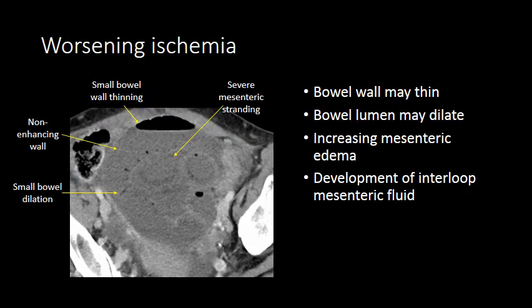As you see the ischemia worsen, you will see small bowel wall thinning and a non-enhancing small bowel. As the wall thins and ischemia progresses, the small bowel will often dilate due to inability to peristalse, and you will begin to see severe mesenteric stranding or mesenteric edema. You can also start to see interloop mesenteric fluid, which is fluid accumulating under the leaflets or layers of the mesentery adjacent to the ischemic segments of bowel.